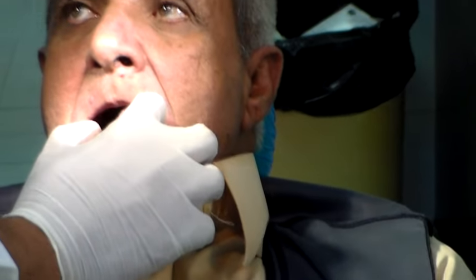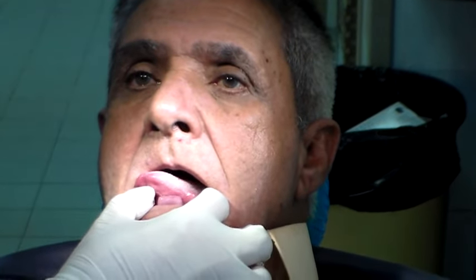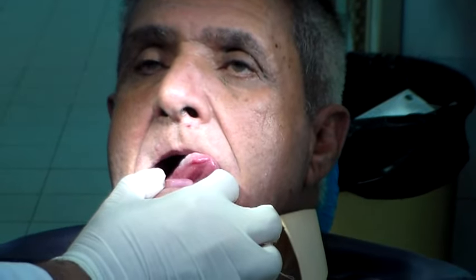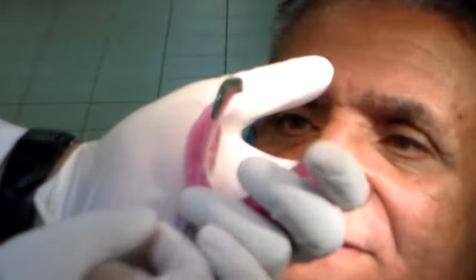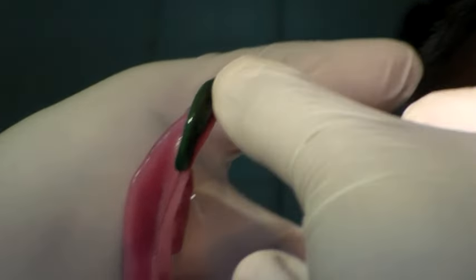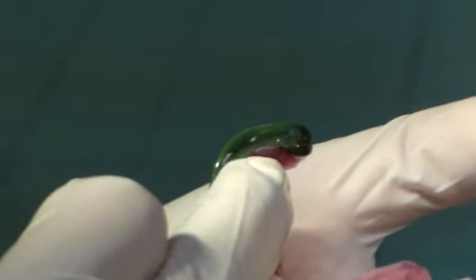Ask the patient to gently lick the upper lip all the way, so that the tongue molds that region of your lateral throat form. You don't want to protrude the tongue. After this movement, take it out and have a look. You can see how the material is forming a small curve — this curve is called the reverse S curve.